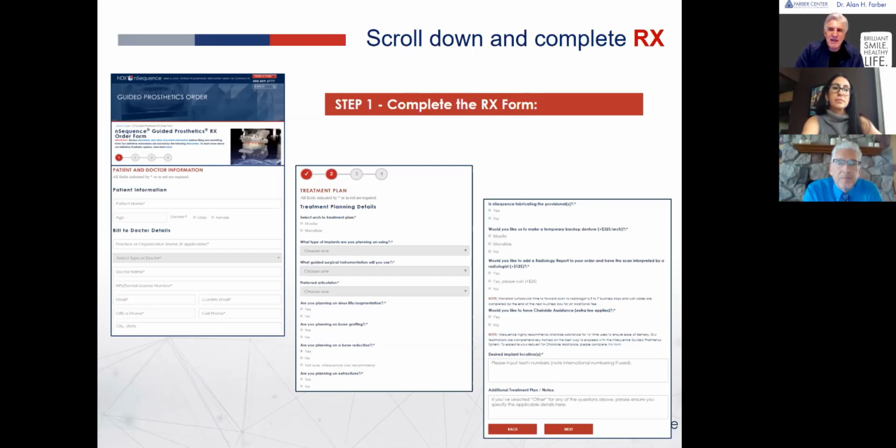Let's play it really safe. Let's have a backup denture. And in the last 5 years, I think I've ordered 2. Fortunately, I haven't had to use them because there's been situations where, like Jeff said, I cut the provisional shorter because we weren't getting good torque in some of the implants. So it's really a few $100 decision to make. Do I want to spend $300 or $325? Yeah. So we make that decision right then when we're planning it. And if not, like Jeff said, worst scenario is we get one in 3 days. So it's not terrible for us anyway.